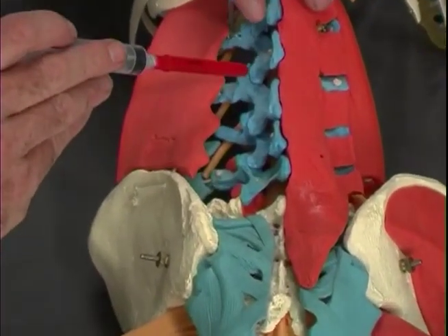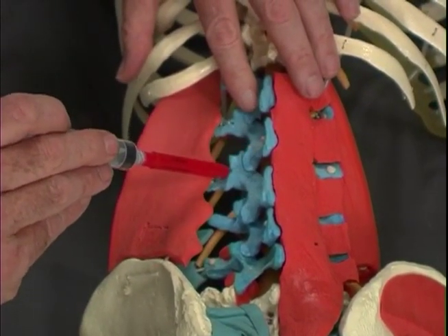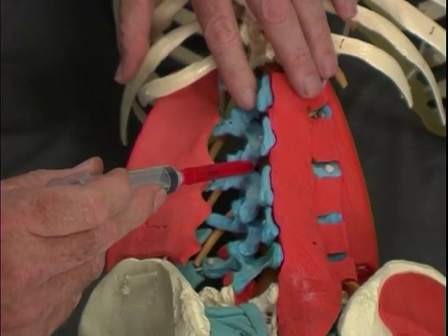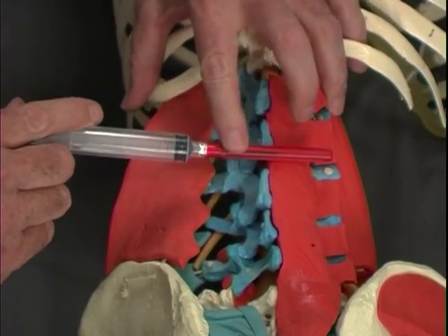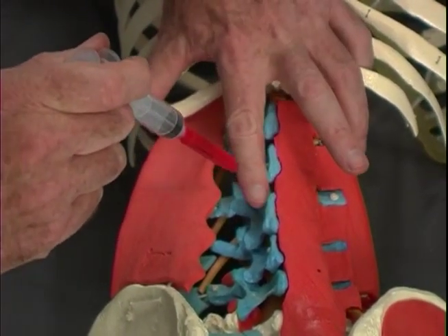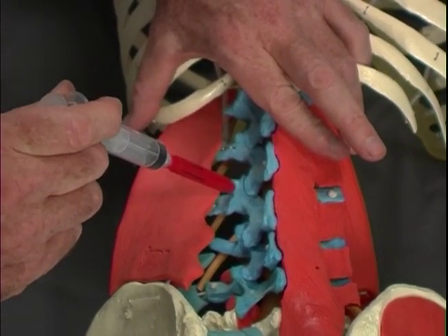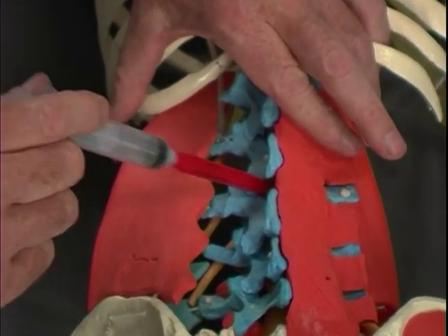Our next line of injections are into the facets or the facet area that we can see here. Again, we're not attempting to enter the facet directly, but really the capsular area around it. We know that in most patients, those facets lie in a direct line with the interspace, so that if we come a finger breadth off and down into that area, we will be in the area of the facet capsule. We need to be careful not to go too medially.